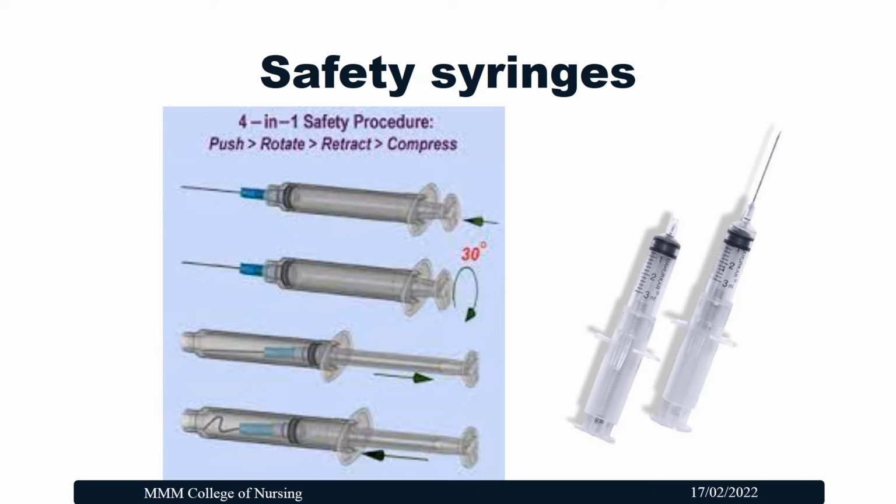In auto disabled syringes also, the needle will be retracted inside, so that there is no chance for needle stick injury.